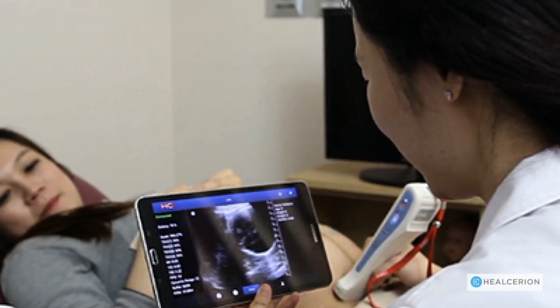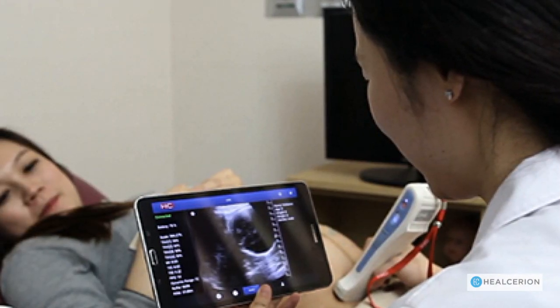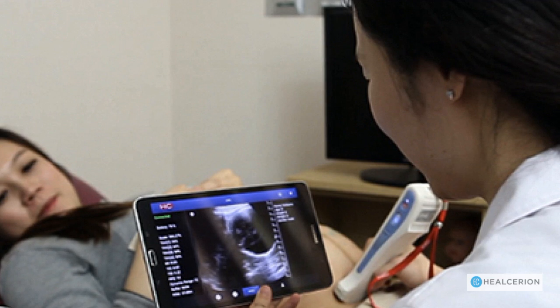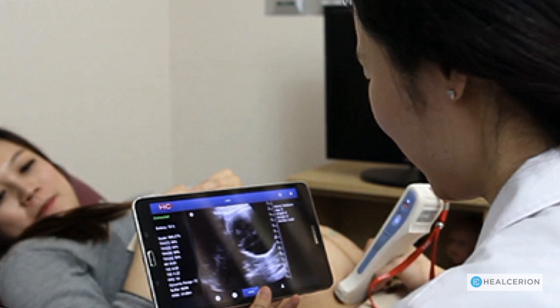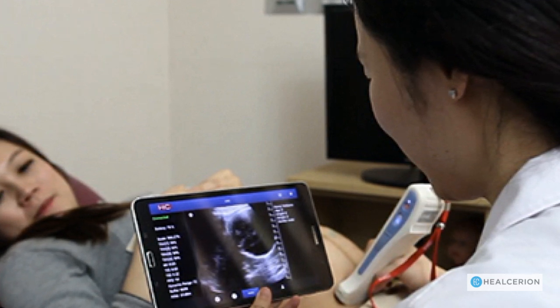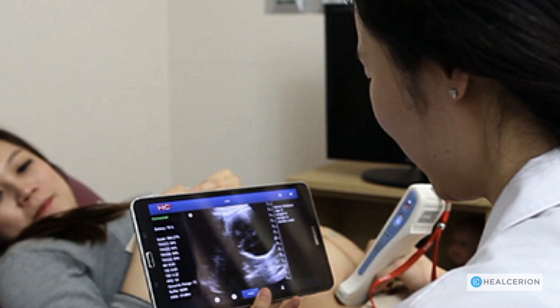The Sonon 300C ultrasound is a fast, easy, and complete imaging solution for obstetrical studies.